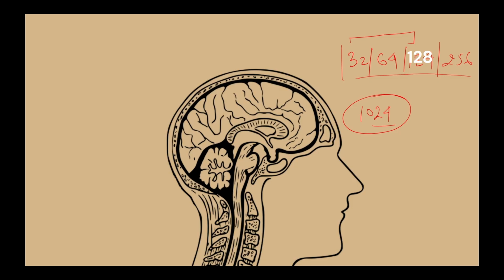So how do we measure the electrical activity? This is our brain. We put electrodes on the surface of the head, and we measure the electrical activity. We use an amplifier and we get the electrical activity, how it changes over time. And remember, these are in microvolts. It's very tiny.